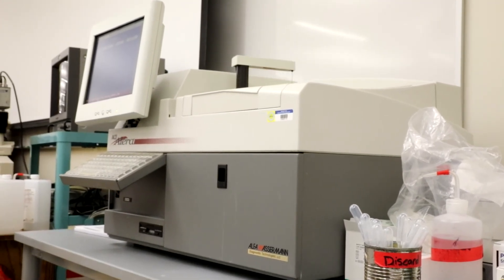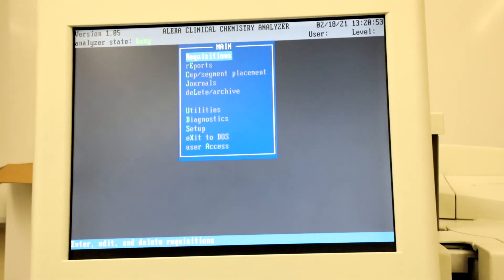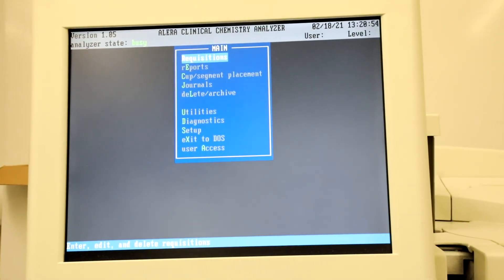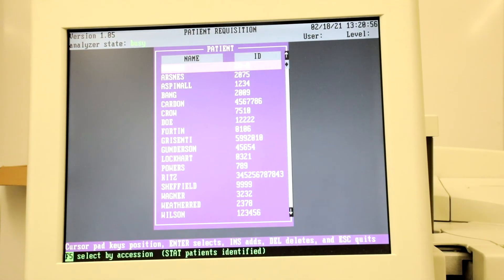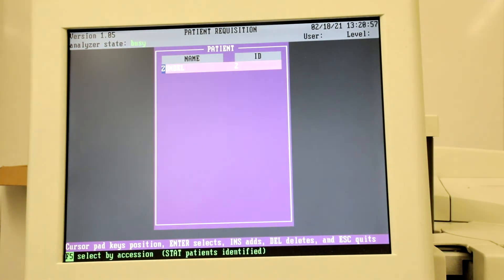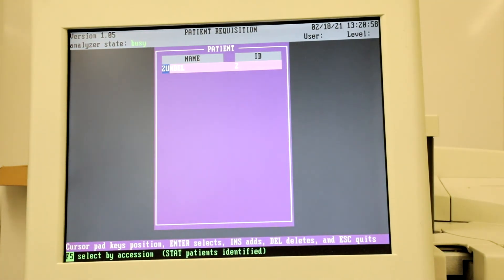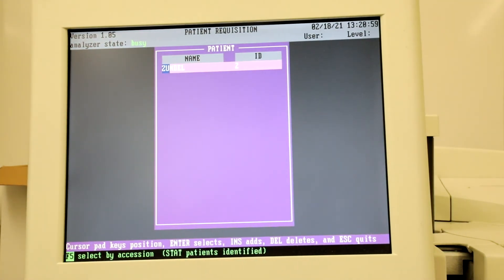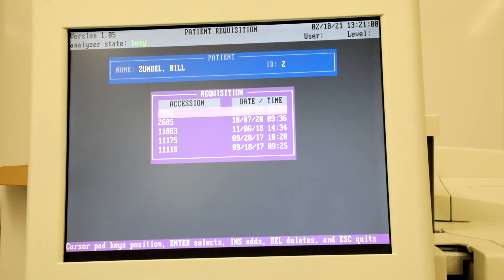To check results, at the main menu select Requisitions, then Patient, Your Name, and then the appropriate accession.